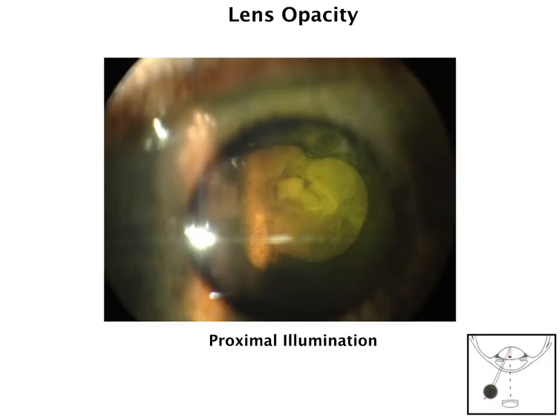As we look at this next picture, we can see a rather significant lens opacity, and with something this large, the best way to image it is using proximal illumination. Again, this is where we shine the light next to the area of interest, and that allows the light to kind of diffuse over and capture the full extent of that pathology, as you can see in this picture.